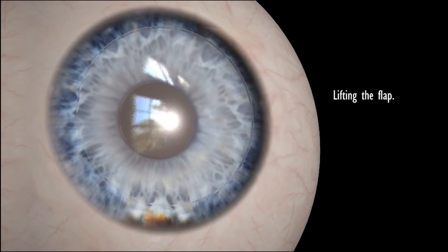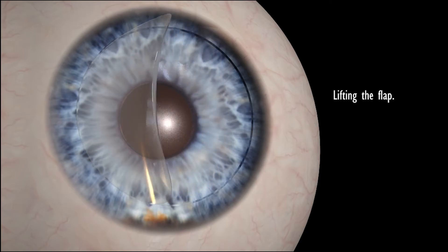Once the layers of the cornea are separated, the flap, remaining hinged on one side, is then lifted back uncovering the stroma or middle section of the cornea.